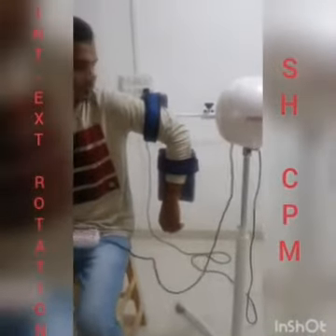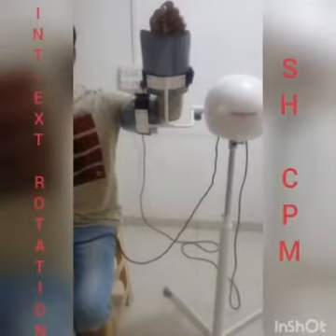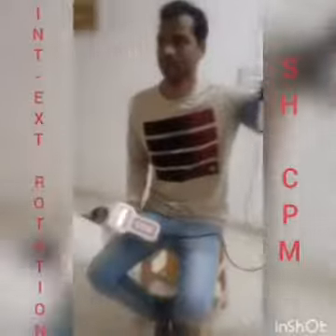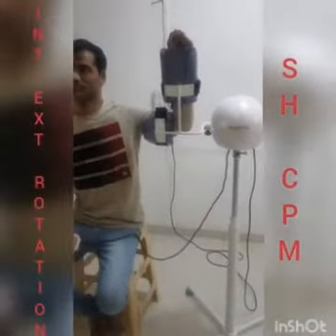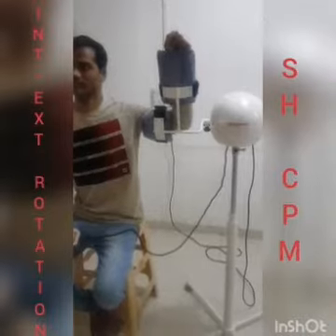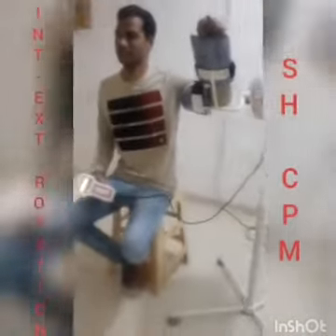Now you are ready for the treatment. Switch on the power button and set the splint angle. The process of the remote control is the same for all the movements. This is the movement of internal and external rotation.